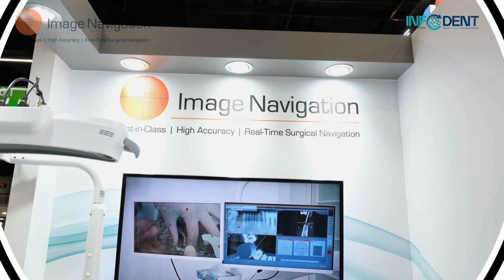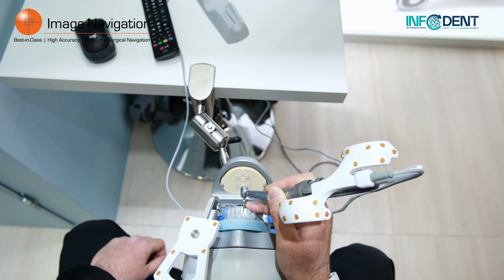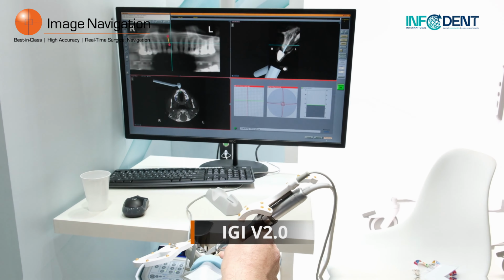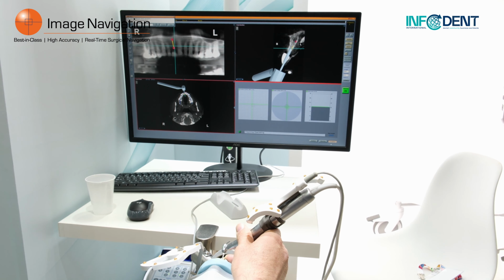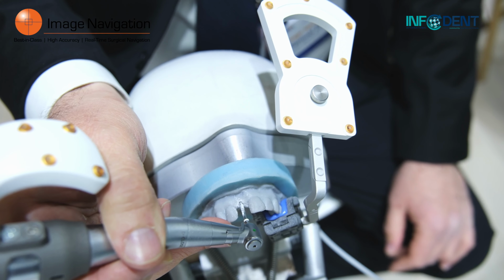We're happy to introduce our new generation during the IDS, now with a new IGI navigation system for implant placements. This is a dynamic navigation system that allows the surgeon to place implants in real time by looking at our tracking system during the procedure.